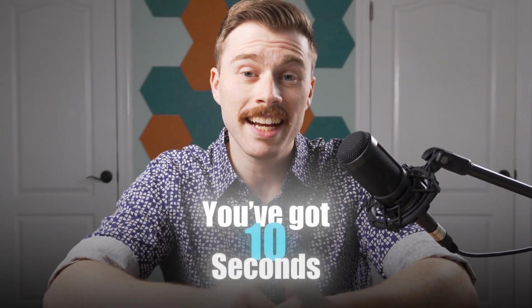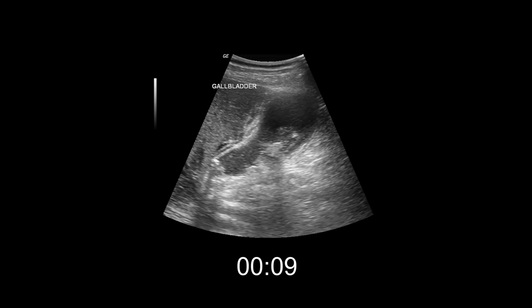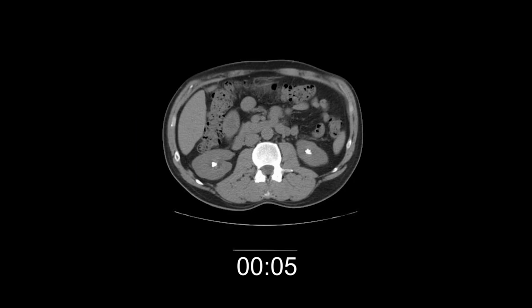You've got 10 seconds. Diagnose these images or repeat medical school. Look, if you see a coffee bean on your boards, it's not break time. It's a volvulus and someone's about to lose their colon.